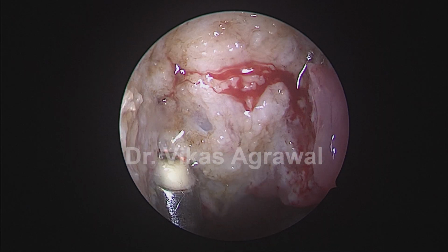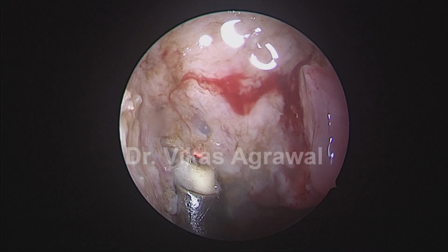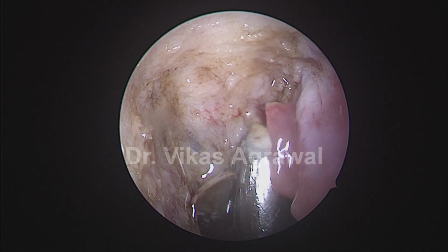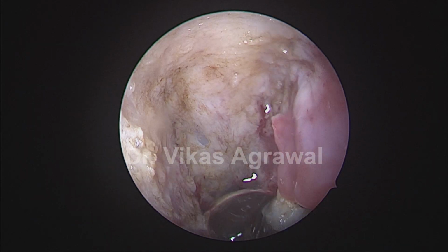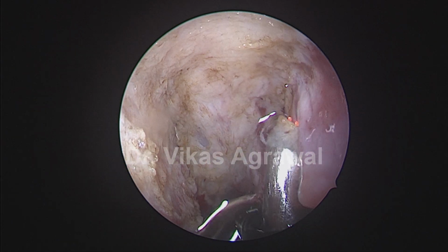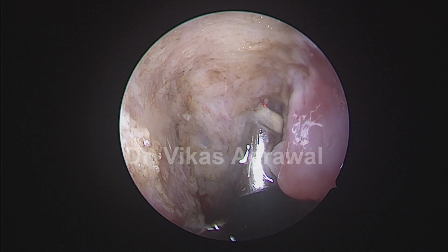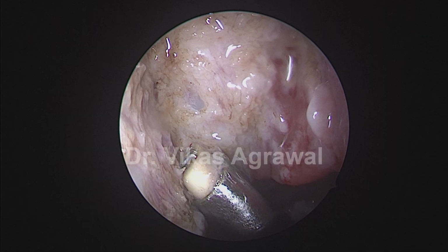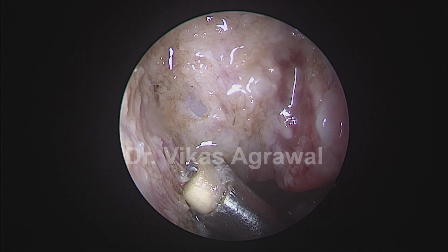Still some amount of lymphoid tissue is hidden. Let me see what's trickling from there. Alright. So there's hardly any tissue left over here.